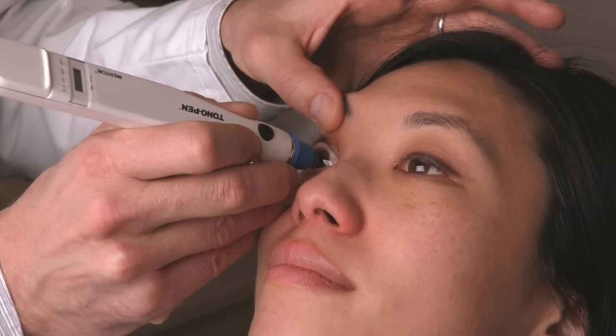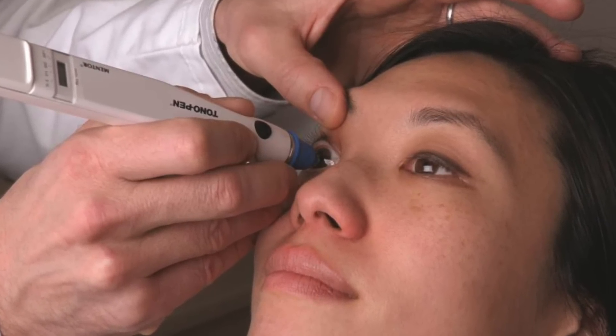To use this instrument, the first step is to lie your patient on their back and anesthetize their eyes. Originally this was done using cocaine, though today ophthalmologists use related alkaloids including holocaine or proxymetacaine. I can personally attest that these anesthetics are very effective — I once underwent applanation tonometry with a more modern digital instrument, and the ophthalmologist didn't tell me what he was doing. He just gave me some eye drops and appeared to be examining the interior of my eye, and it wasn't until after he was done that he revealed he was actually pushing directly on my eyeball. I didn't feel a thing — a very odd experience.